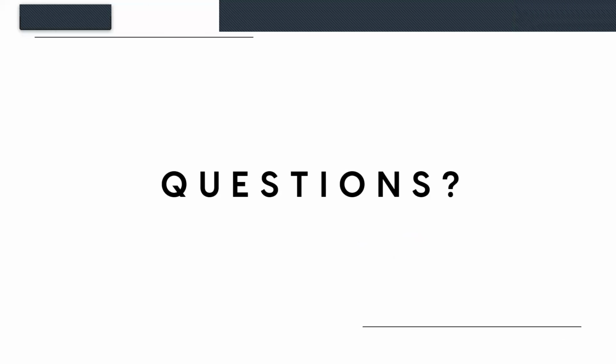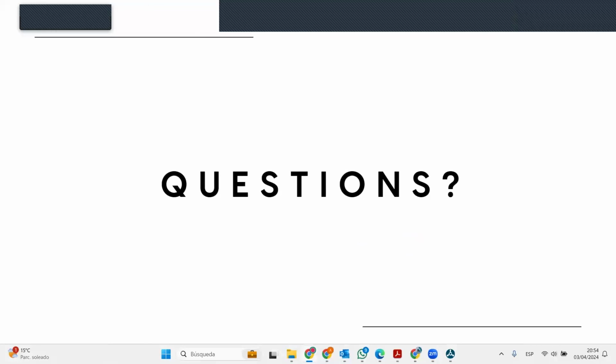So, Dr. Colón, I have two more poll questions that I could launch right now. The first one is, do you feel confident in the CAD that you're using for your offerings? If you wouldn't mind just answering. And I do have a question that one of our viewers came up with. They want to know, does the software have more design options or just implant bone reduction and ortho?